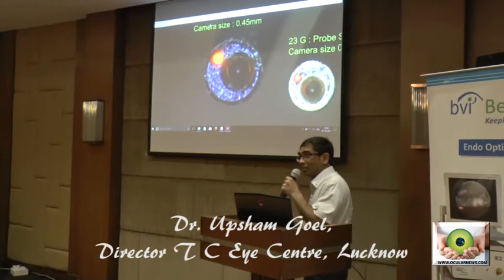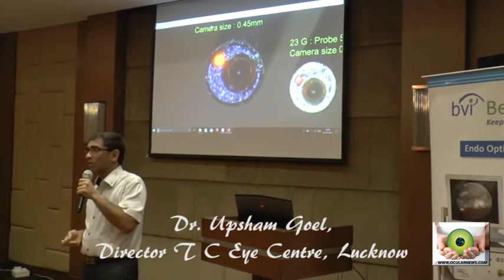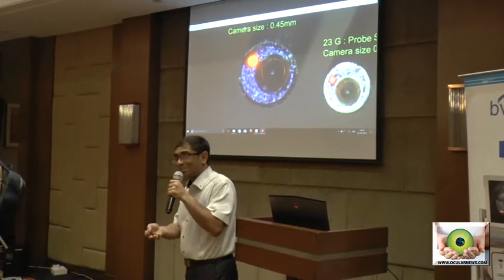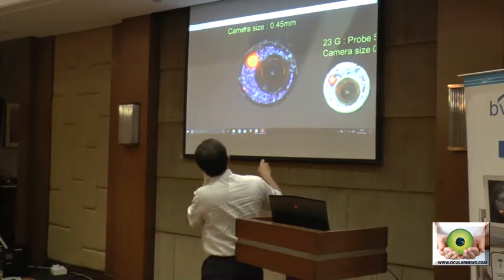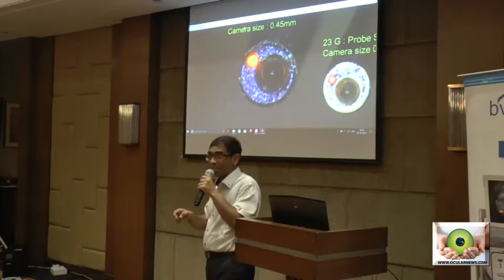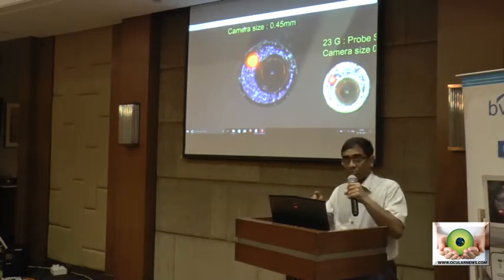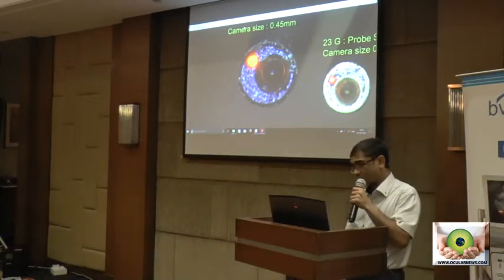But I waited, because the 20 gauge technology was already there, but I kept on waiting because I had already shifted my vitreoretinal surgery from 20 gauge to 23 gauge to 25 to 27. So I waited for years for this probe to come along, and that's 23 gauge. Look at the crazy kind of technology. They already had a 450 micron camera sitting in that little probe, and this one comes with a camera size of 350 microns. Some people might still like the 20 gauge probe though, because it gives you a wider field of view. But the quality of the optics is already very, very good.